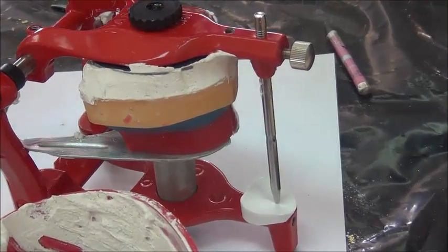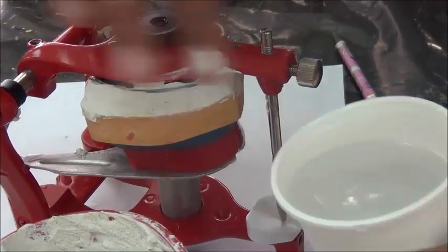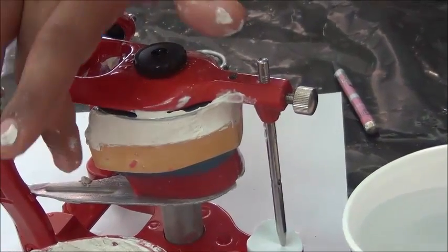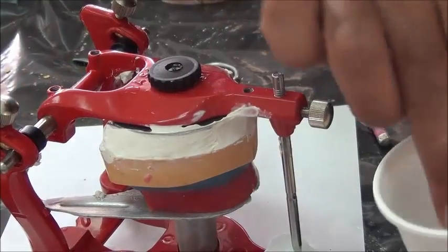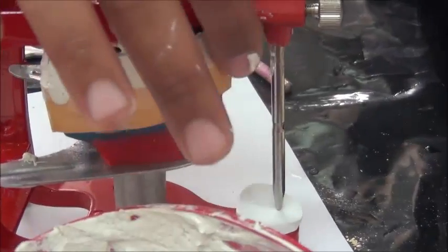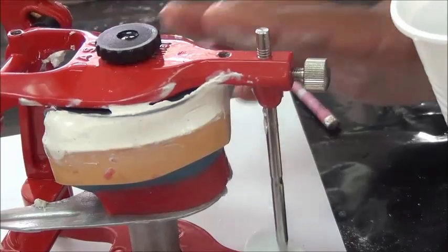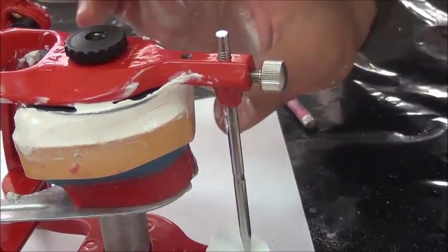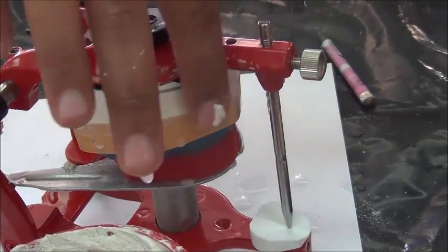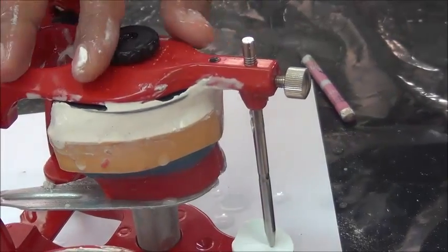Then once all excess is removed, you can use your wet fingers to further smoothen and remove excess and smoothen the mounting, making sure that the plaster went into the indentations we have carved in the cast. You can see how the plaster went and covered those indentations. We clean the cast from all sides and wait for it to set, ready for the lower mounting. And we could wipe away the excess plaster over the articulator member using a wet napkin.